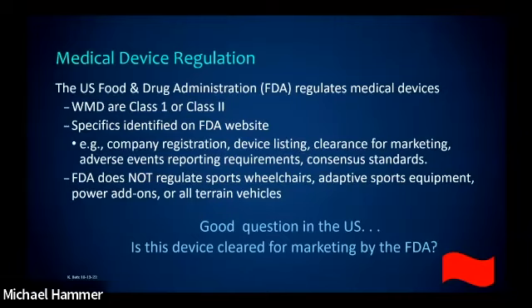If you ask, is your wheelchair approved by the FDA? I hate to say it, but that's kind of a dumb question that we hear all the time, right? We always say there's no dumb question. It's kind of not the right question to ask. Is your device approved by the FDA? Because they don't approve it. So it'd just be kind of a crazy thing. I put up all my slides; they're just my reminders. I don't have notes. I don't look at anything. But the red flag is if you ask, is your device cleared for marketing by the FDA? And the answer is no, or I don't know, that is a red flag. Okay, in this industry, that is a red flag. So you're looking at that.